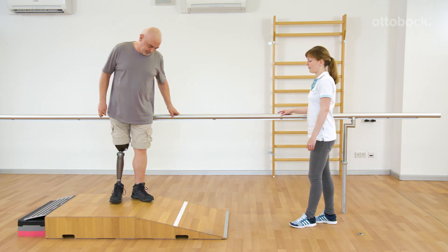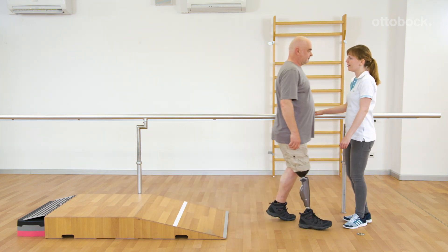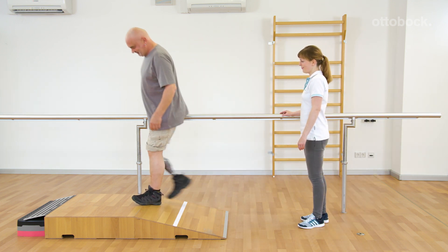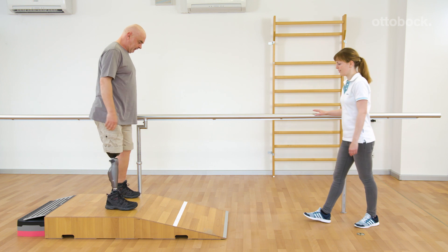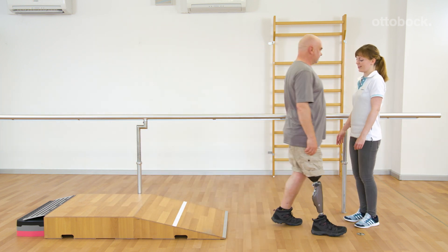Avoid knee extension during landing. It is important to have a good fitting socket and an adequate stance flexion resistance, to avoid pain during movements and to provide proper support.